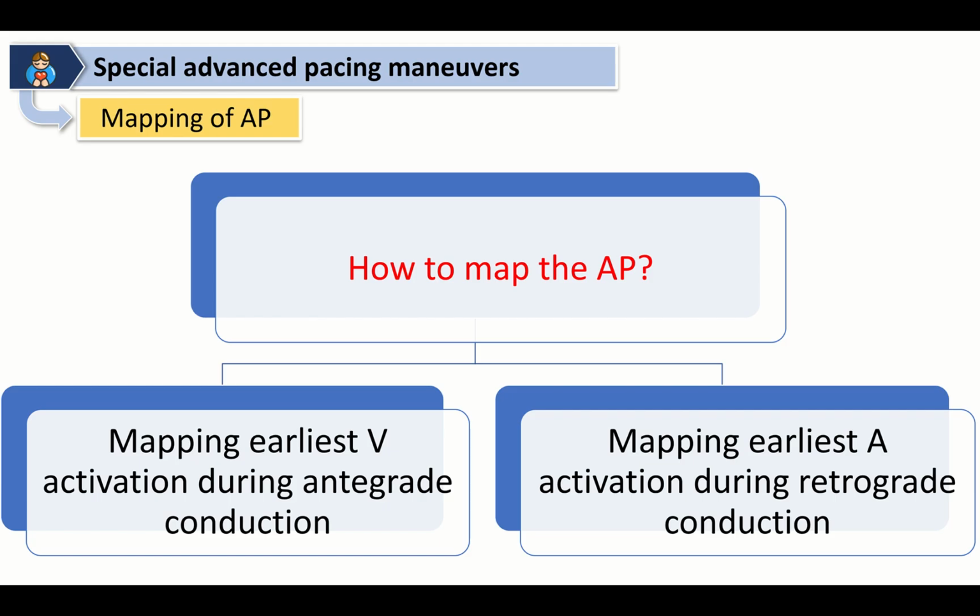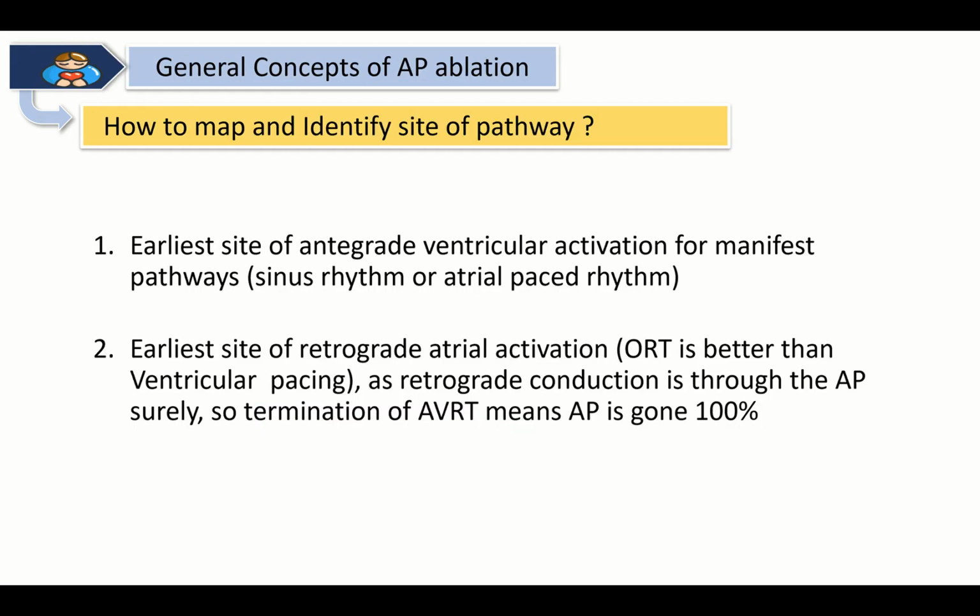Second approach, mapping the earliest atrial activation during retrograde conduction, when the patient has tachycardia, AVRT, orthodromic tachycardia, or when we perform ventricular pacing.